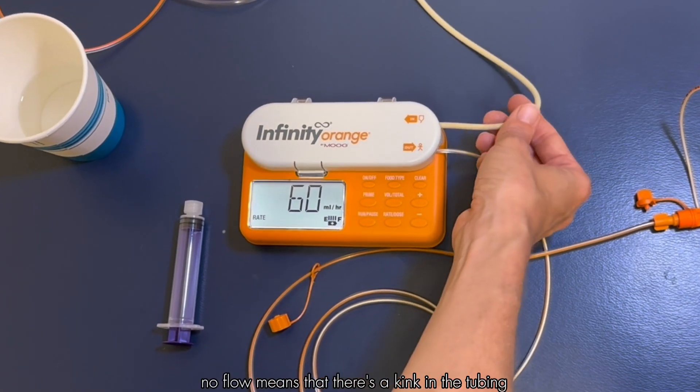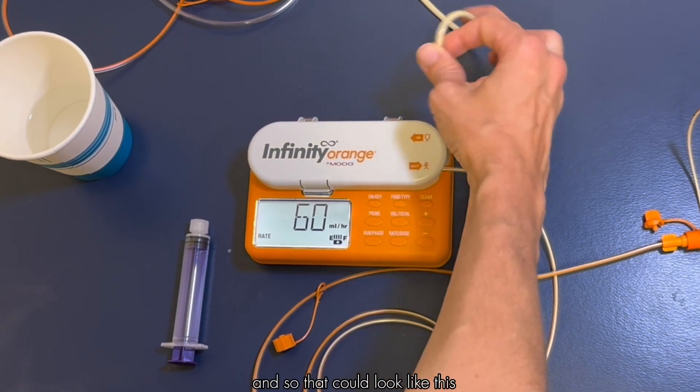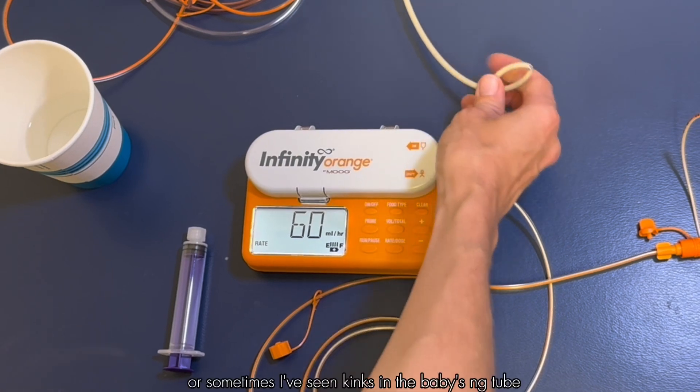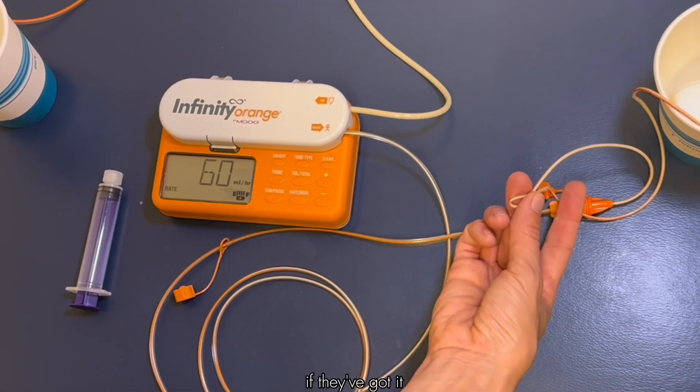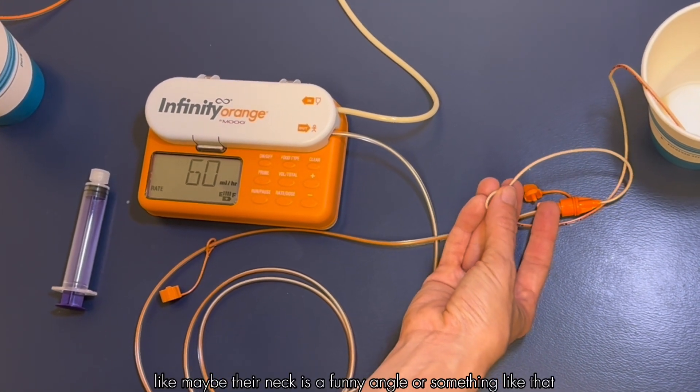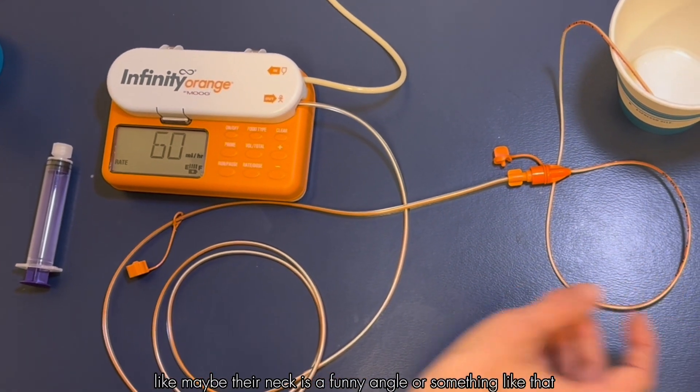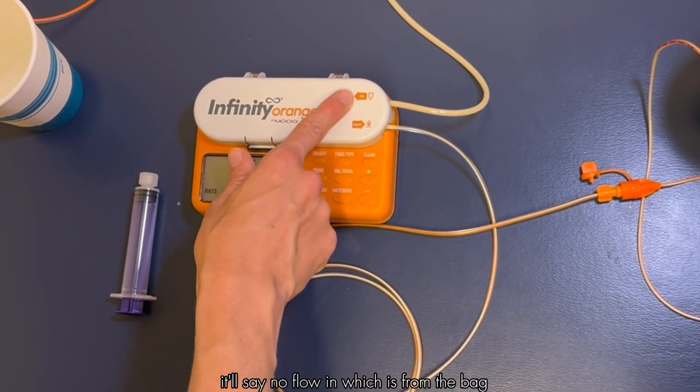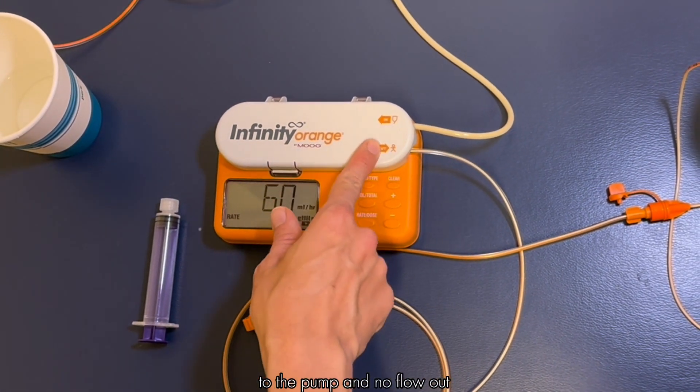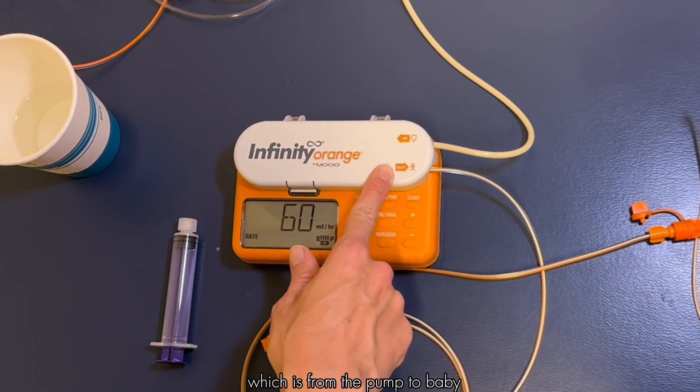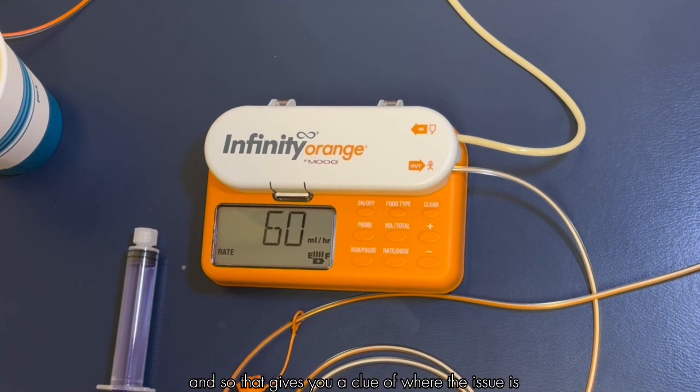No flow means that there's a kink in the tubing and so that could look like this, or sometimes I've seen kinks in the baby's g-tube if they've got it like maybe their neck is a funny angle or something like that. They'll say no flow in which is from the bag to the pump, and no flow out which is from the pump to baby, and so that gives you a clue of where the issue is.